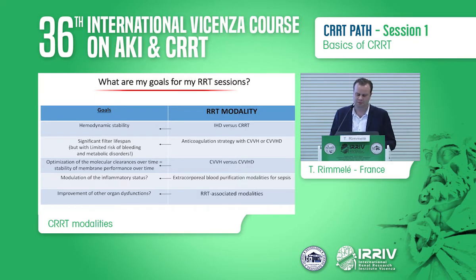And I think yes. For the stability, you can discuss if you want intermittent hemodialysis or a continuous therapy. For the significant filter lifespan, of course, you're going to play with your anticoagulation strategy. And I would like to show a few slides about the anticoagulation strategy depending on continuous hemofiltration versus continuous hemodialysis.